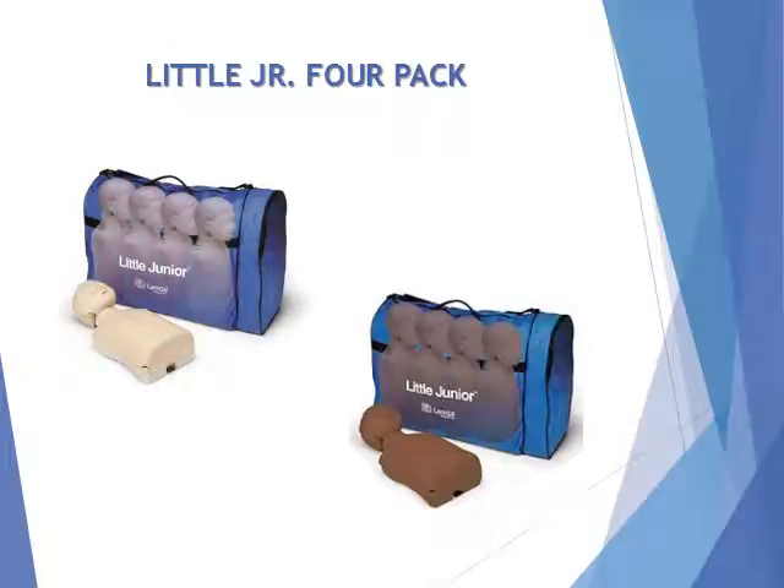Little Junior 4-Pack. The Little Junior Mannequin meets your need for a low-cost, lifelike child CPR trainer and is the perfect supplement to the Resusci Junior Mannequin. Our package of four Little Junior Mannequins makes hands-on practice affordable for every student.